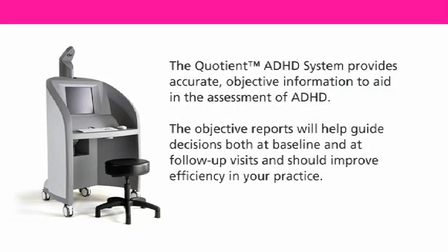In summary, the Quotient ADHD system provides accurate, objective information to aid in the assessment of ADHD. The objective reports will help guide decisions both at baseline and at follow-up visits and should improve efficiency in your practice.